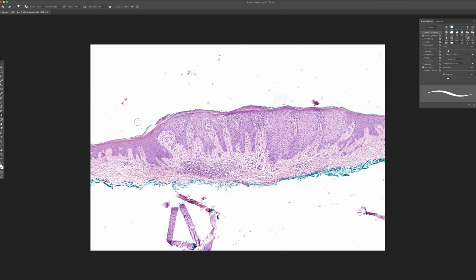So the next option is to use the eraser tool. And as before, one starts with a fairly small icon so that one doesn't brush too much off at one time, and then we follow the surface of the skin specimen like this, remembering to stop every so often so that you don't have a problem if you make a mistake, and we'll work our way along.